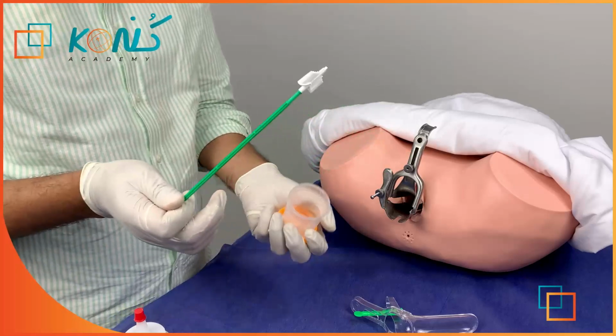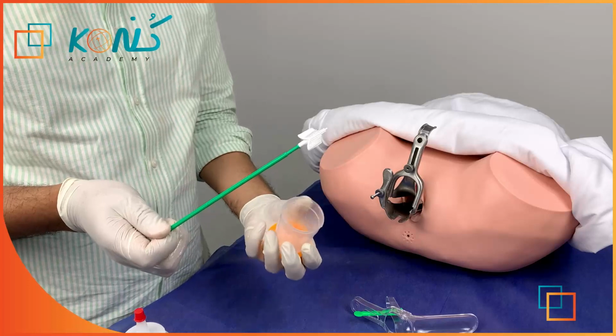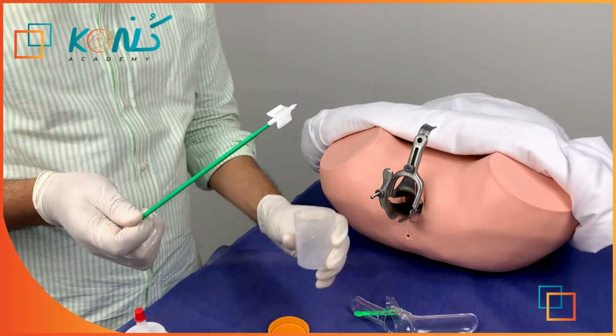And I told you we have 2 ways in this cervical smear: a way called the SurePath technique and a way called the ThinPrep technique.